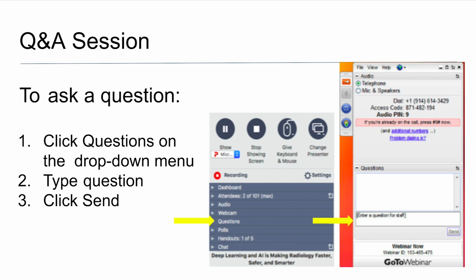Next question. Is this actually low-dose PET? It seems like PET is not needed at all, or why is it needed? Oh, definitely it is. We leverage the information not only in the PET but in other modalities. For example, for PET CT, the CT has very high definition, high resolution, high quality information, which can be leveraged to improve the quality of the PET, where the PET captures the molecular activation, the function that is very important for oncology detection, staging, or neural disease detection and diagnosis.